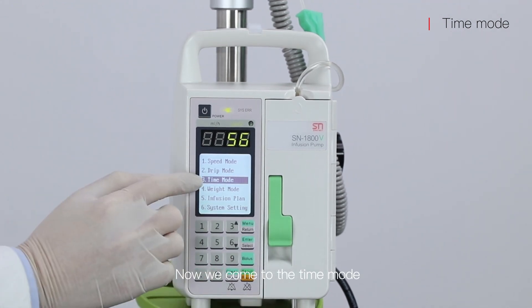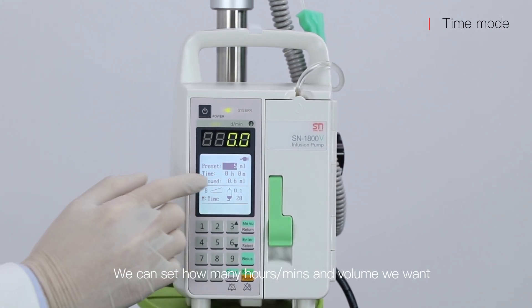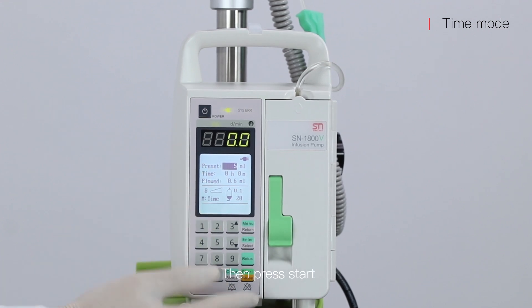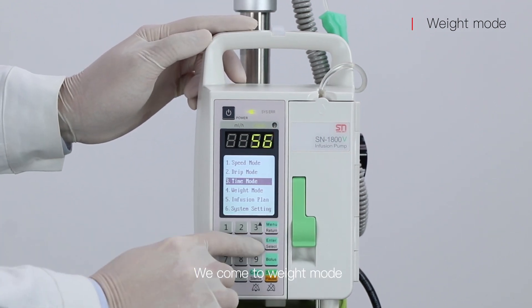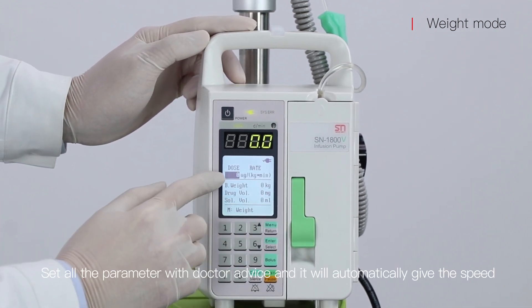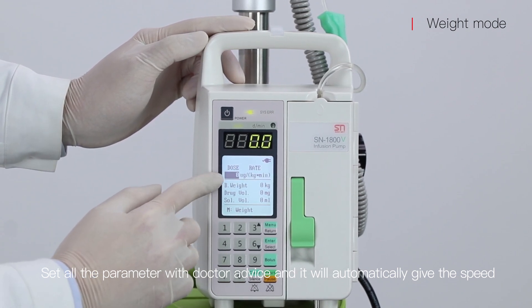Now we come to the time mode. We can set how many hours, minutes, and volume we want, then press start. We then come to weight mode — set all parameters per doctor's advice and it will automatically calculate and deliver at the correct speed.